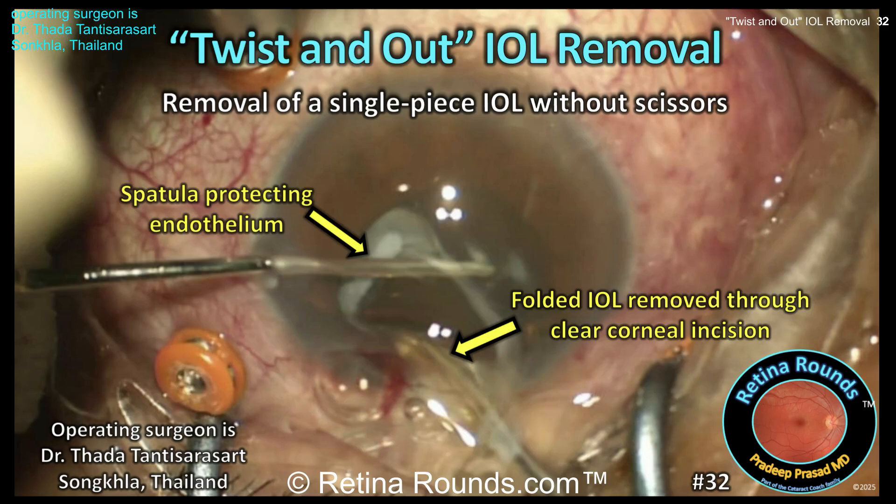Retina Rounds episode number 32, twist and out IOL removal. In this case, we'll show you how to remove a single-piece IOL without the use of scissors, and we want to thank Dr. Thada Thantisararsart from Thailand for contributing this case.